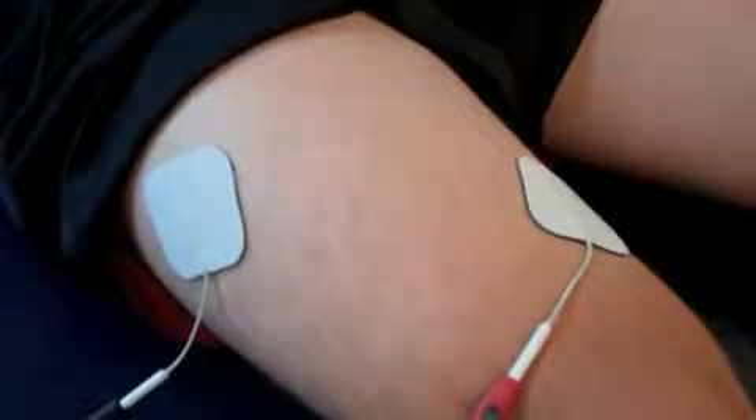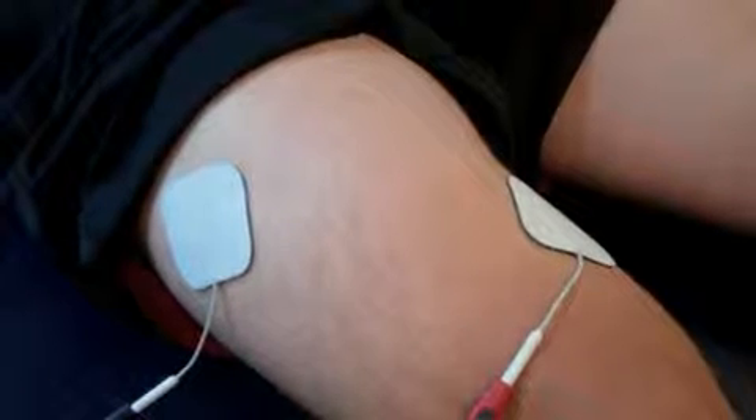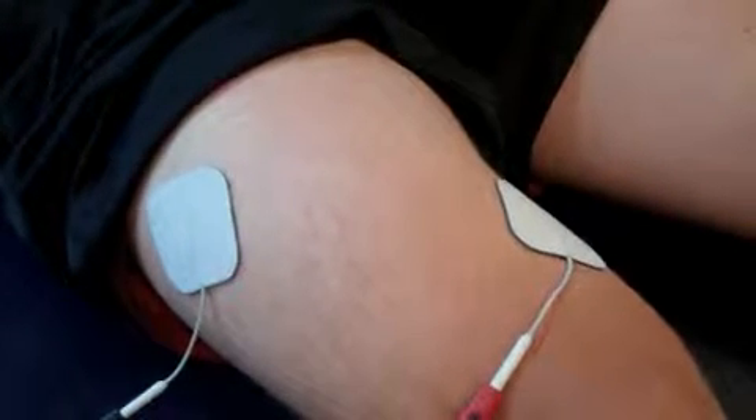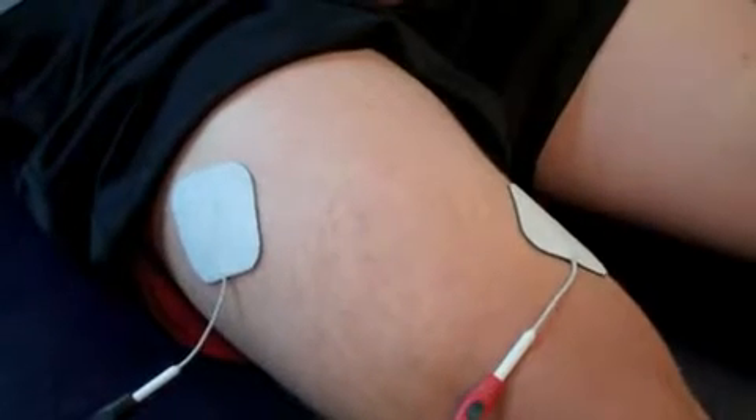So we've got our contraction. Our cycle time is 10 to 10 — 10 seconds on to feel the contraction, and he helps it with a voluntary contraction. And when it shuts off, then he relaxes.